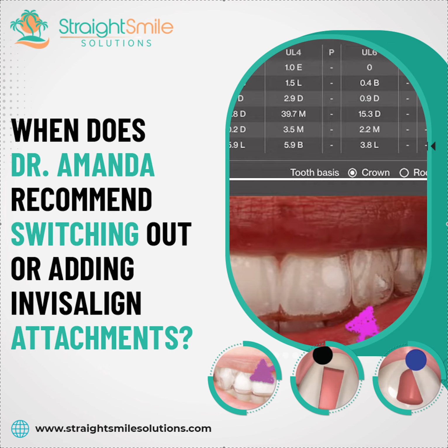So why are people switching out, doing all these weird, I need this horizontal beveled 5mm attachment? Why are you guys doing this? You guys are doing extra work. You don't need to do this. Trust me, I've seen a lot of cases done.